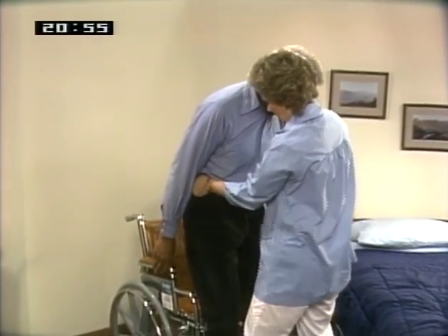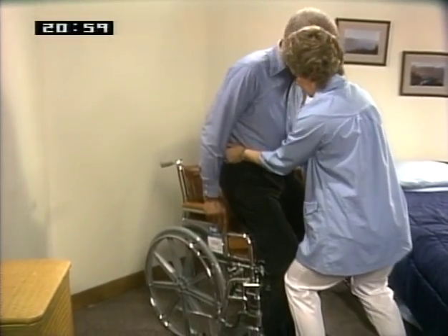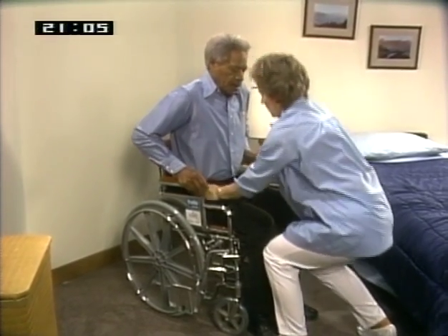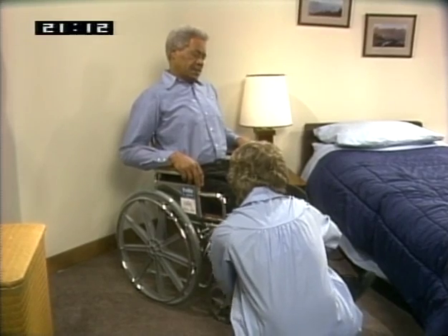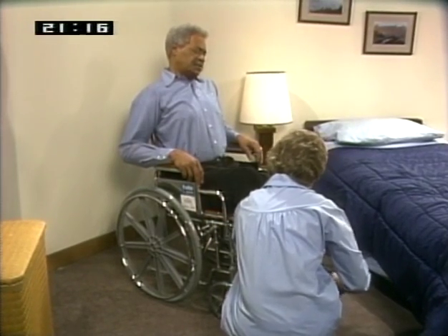Have the patient grasp the far armrest and then move a bit further so he can grasp the other armrest. Ease the patient into the chair. Be sure to bend only at your knees and hips, not your back. Adjust the leg and footrest of the wheelchair and tend to any comfort needs. Document the procedure and any important observations. To transfer the patient from the chair back to bed, you would reverse the process.